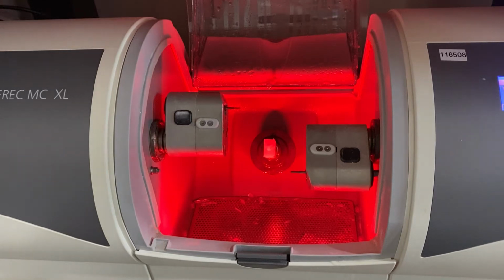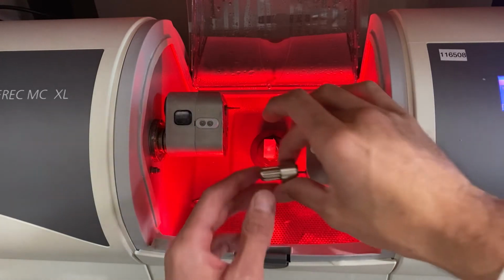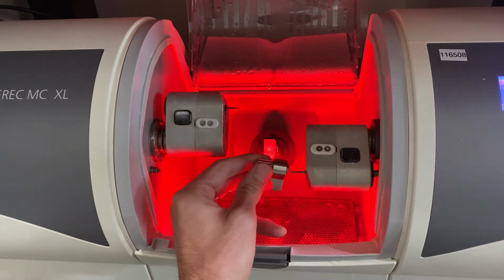Okay, team, so today we are going to replace a burr on the CEREC. We got an error message. It'll light up red. Today's message says the instrument cylinder pointed burr 12S is defective. Please replace it and press start to continue. We're not continuing this because we don't need the restoration.